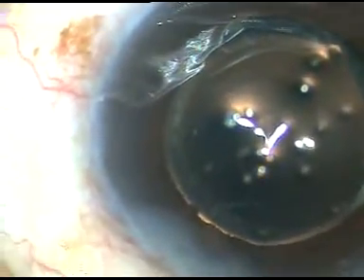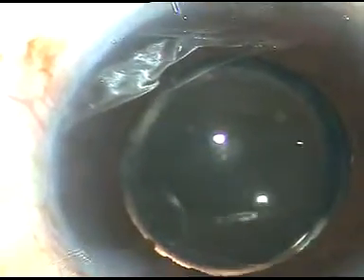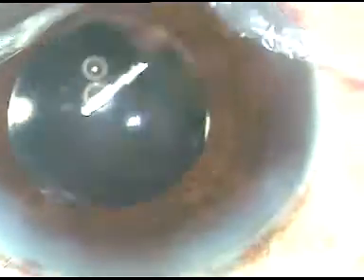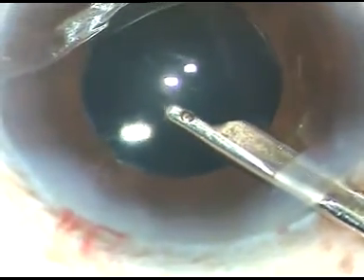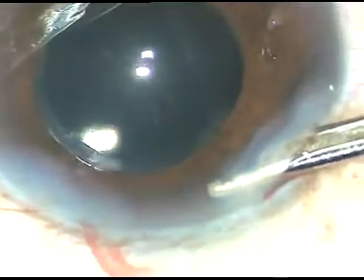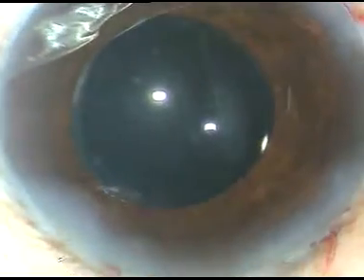Now a final wash with balanced salt solution from Intas Pharmaceuticals is performed. After the final wash the anterior chamber is formed and the case is concluded. Why should we learn this? Because in some cases hydro-dissection may not be safe. If you learn this technique you will be very confident. Thank you very much for your attention.